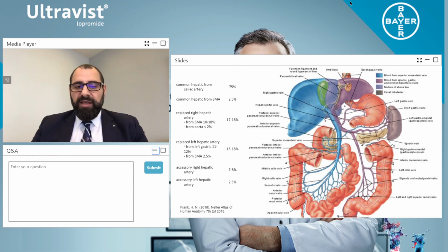So when we're thinking now of doing an arterial phase CT of the liver for detecting disease or oncology applications such as hepatocellular carcinoma, metastasis, we have to wait a little bit longer than what you would normally wait when doing an angiogram to look at the vascular system, because we need to pass through the mesenteric system first into the venous system and then back into the liver to accurately give us good opacification.